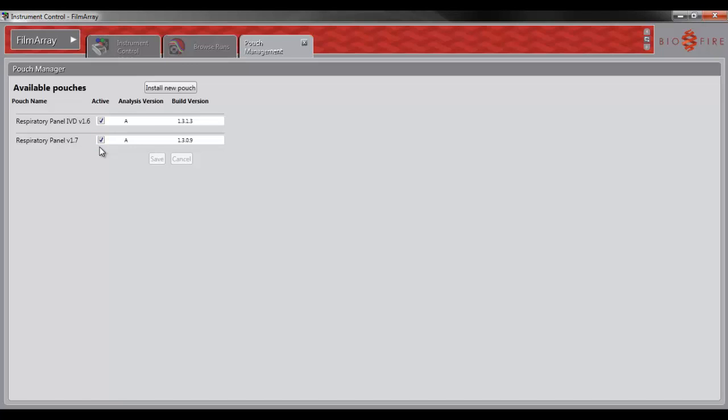If you have a new version of a pouch module and no longer need to use the older version, please uncheck the box next to the version you no longer need. Then click Save.